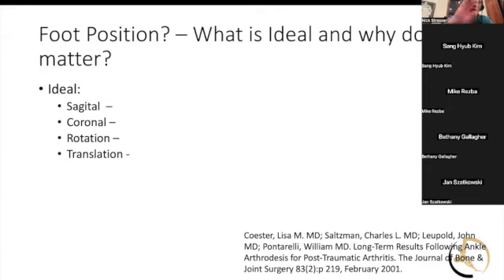Or the dorsiflexion. That's what I meant on the sagittal. How much dorsiflexion? I always think I'm good, and it always looks a little more plantar flexed. I've heard people say go for 5 degrees of dorsiflexion. You'll probably be about right, which I think is actually pretty good advice. Nick, are you saying 5 degrees of dorsiflexion looking at your lateral x-ray, or clinically? That's a good question. I think clinically, that's what I'm really looking at most critically. Sometimes I get a little fooled looking at the lateral x-ray and I think it's pretty good, and then I end up being a little bit more plantar flexed than I think.